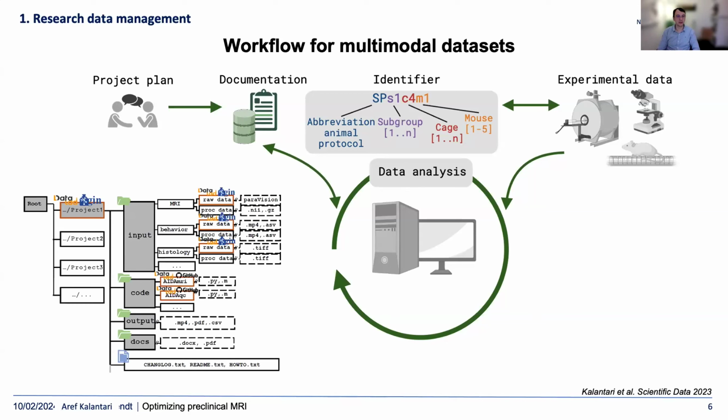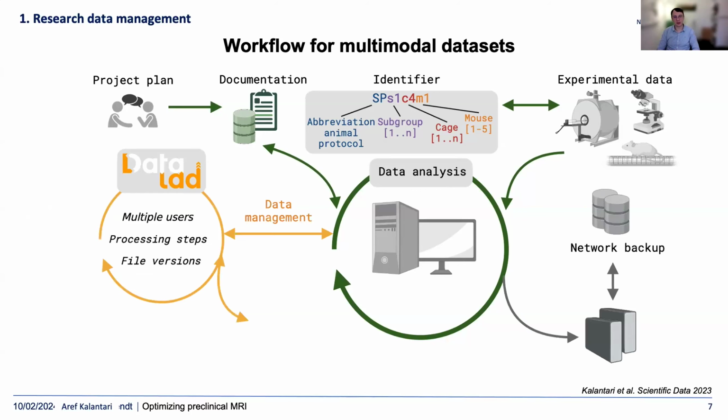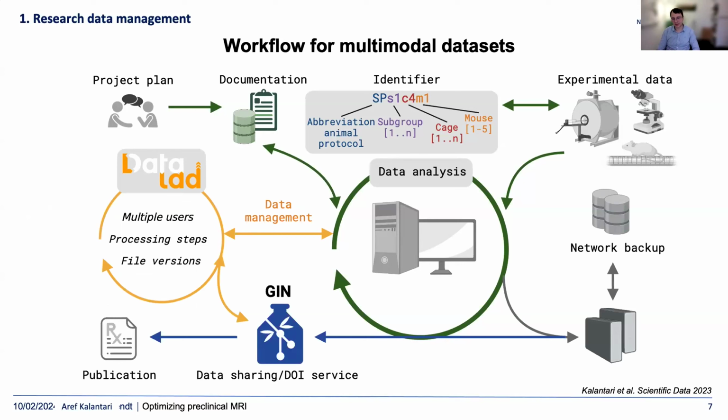Yeah? So if you download any data set from us, you will always find this structure called Yoda structure from computer science. And this gives not only us as humans, but most importantly, computers the way to iteratively search through these data sets. And there is backup. I will not go into detail for that, but there is also version control. We use DataLad. There are other software packages out there. And this is all completed by publishing the data on a public repository for publication.